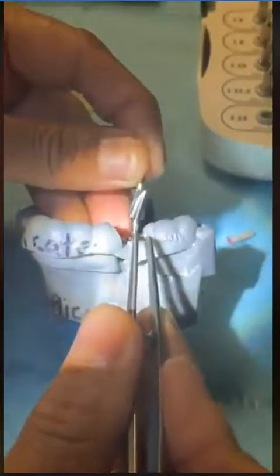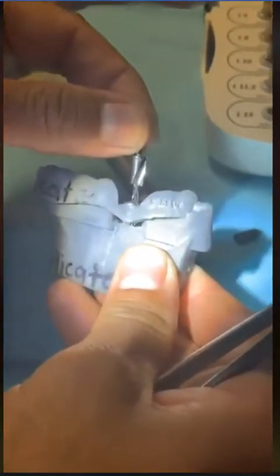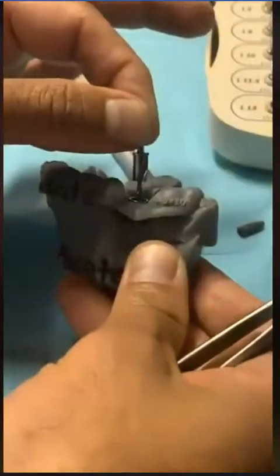Okay? So now, look how much distance you have to go to figure out your trajectory of your implant before you could get a benefit of the guide. It's tremendous. You may not know that. If anybody asks a question, just let me know here.